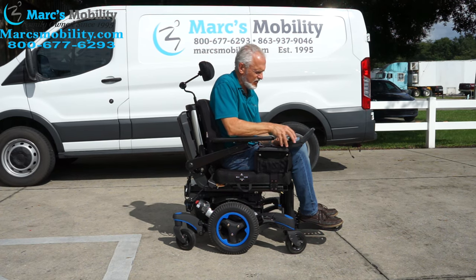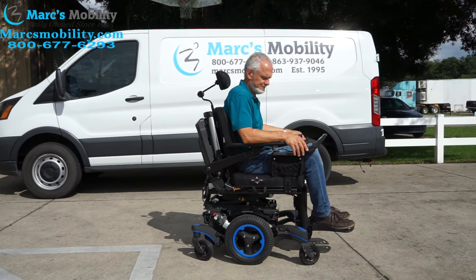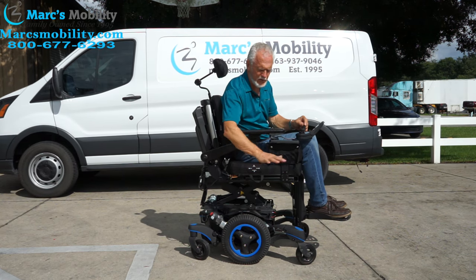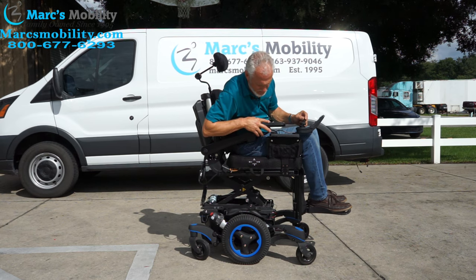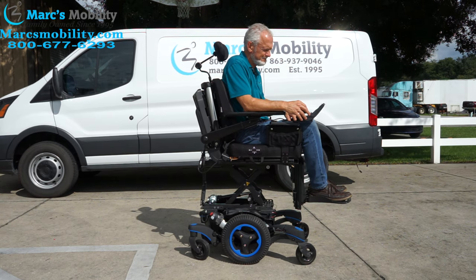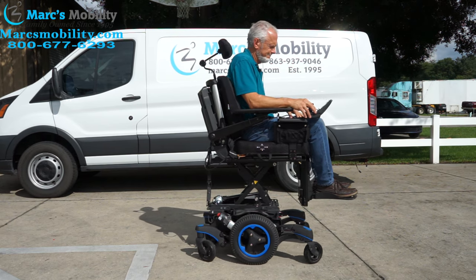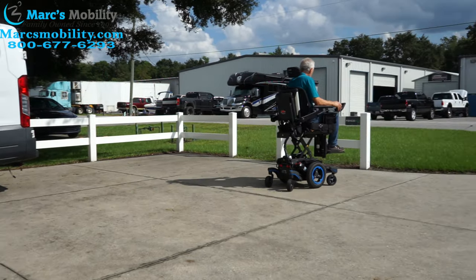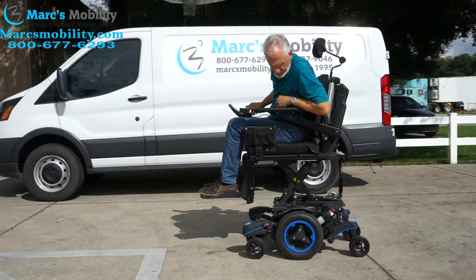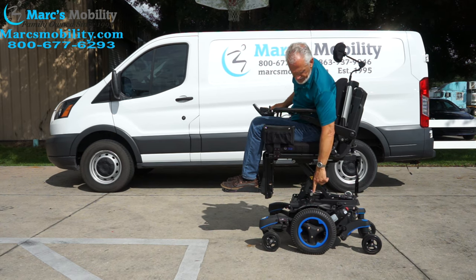I'm going to elevate the seat so you can see it go up, then drive the chair with the seat elevated. When driving with the seat elevated, please stay on a flat surface — not the backyard. This chair will drive at three miles per hour with the seat elevated. It has great motors, tilt, recline, and legs — just a really nice Quickie 700M.